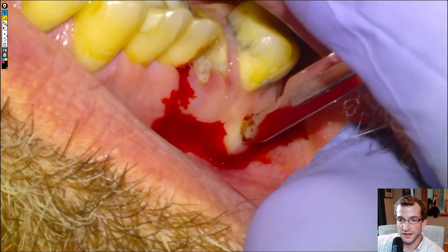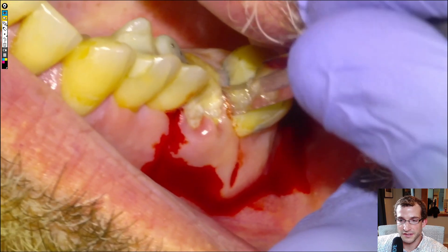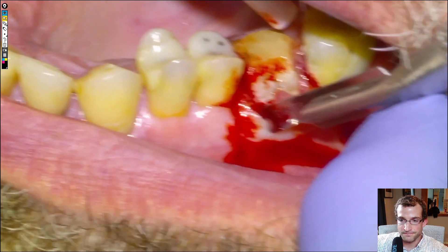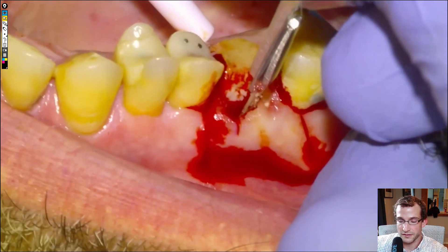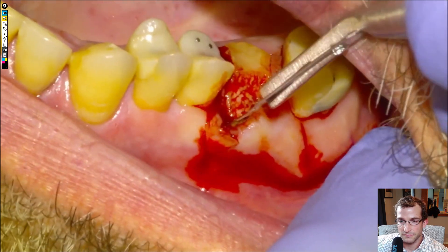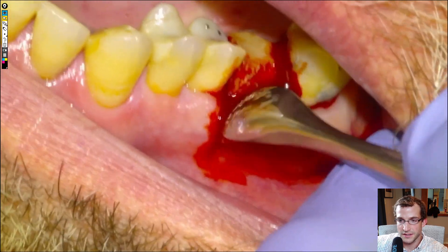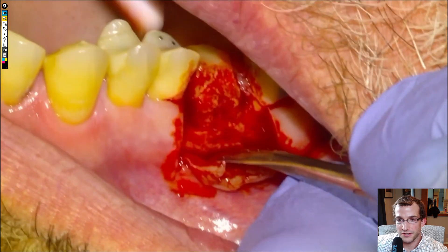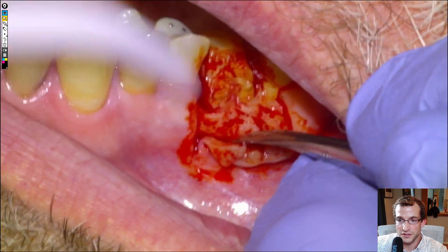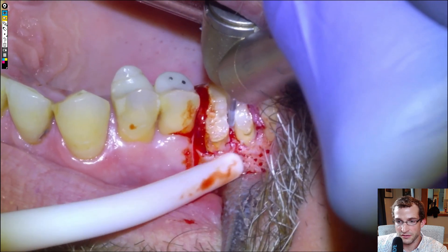We'll continue with a standard flap on the mesial and distal. You do have to be careful with hemostasis for situations like this, so give a follow-up call. Then we'll do a sulcular incision, and we'll nick a little bit of the gum tissue there inadvertently. Once we've separated the sulcular tissue, we'll take a periosteal and peel it back so we can see the buccal bone. This is a situation where you have to remove bone and section the roots because there's not enough tooth to just grab with a forcep and hope for the best.